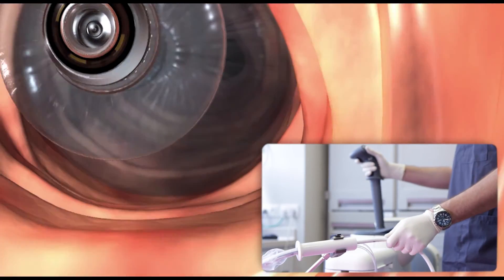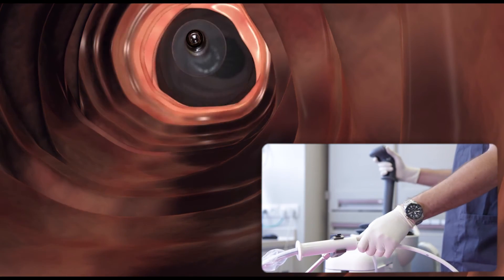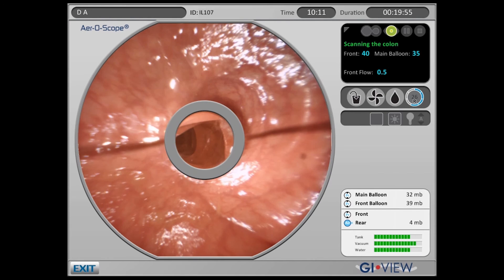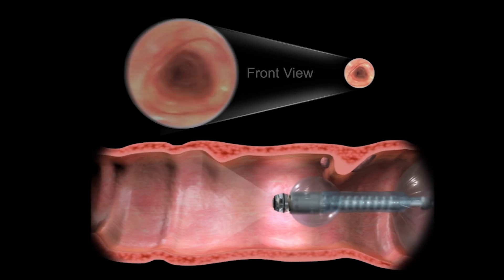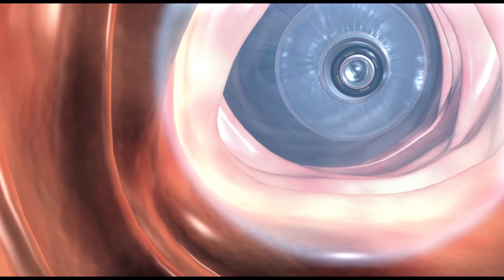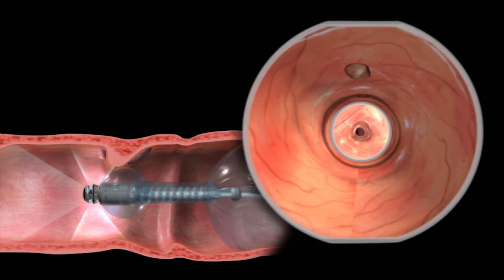Reverse motion is supplemented by the operator retracting the supply cable. The Aeroscope's advanced vision system provides two simultaneous views for visualization of the colon: a forward-looking view and an OmniView, which provides simultaneous 360-degree viewing of the mucosal surface ahead of the capsule, behind it, and to all sides.